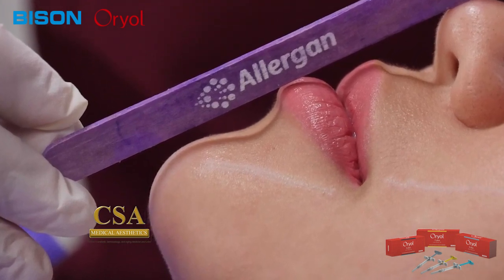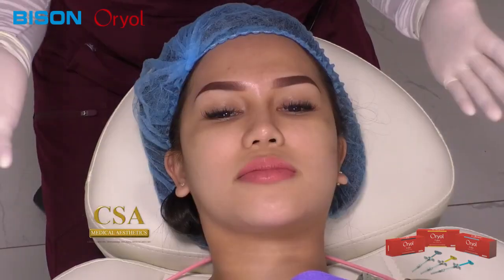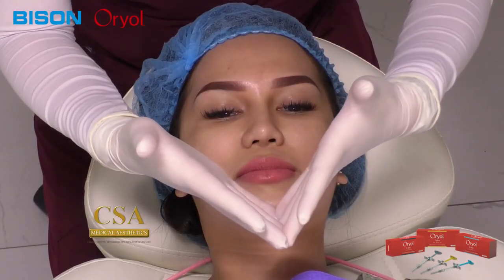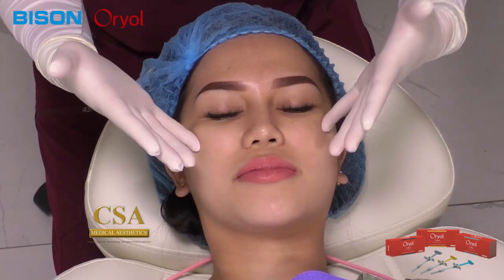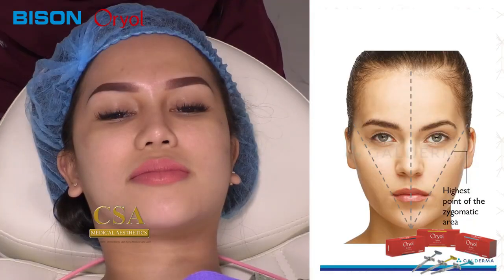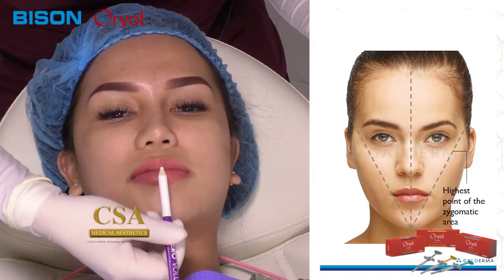So what I'm gonna do as part of the inverted triangle or the triangle of youth is from the center of the chin towards the corner of the mouth to the zygomatic prominence towards the temple, we'll be doing a treatment for Kim Liana. Okay? So, make your markings. Okay, I need a ruler and the center will be this chin part here.